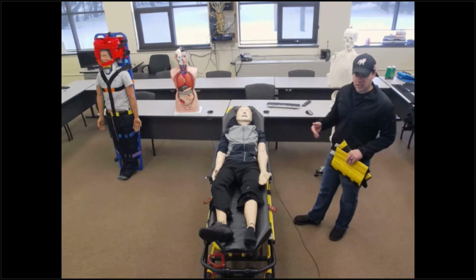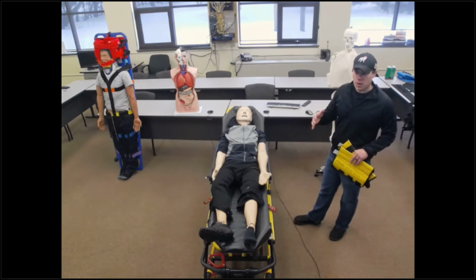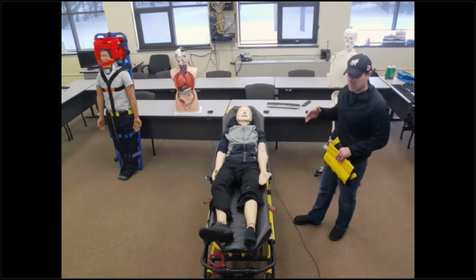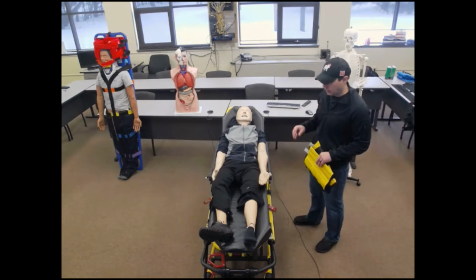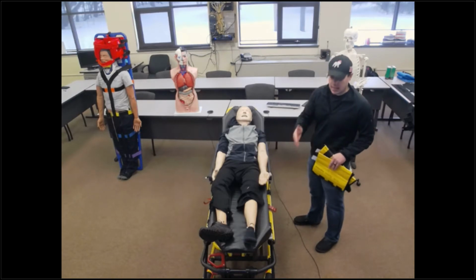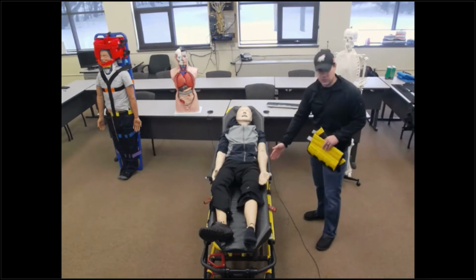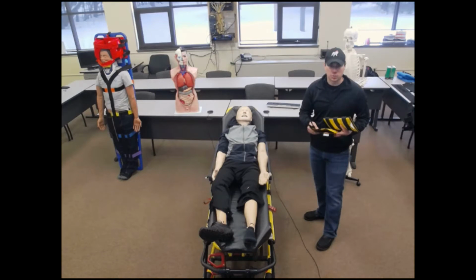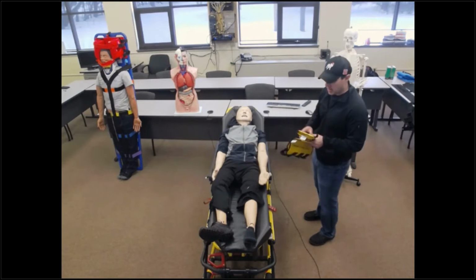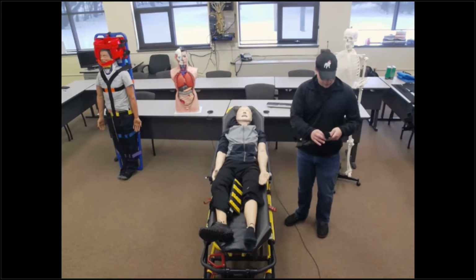I have isolated injuries. Because of that fall, I'm going to still go ahead and do my rapid and detailed trauma assessment, identifying any other types of immediate life threats. I've done that, and again, I have isolated injuries specifically to the left ankle and specifically to the left wrist. So I'm going to use my prefabricated splints to go ahead and apply my stability for those injuries.